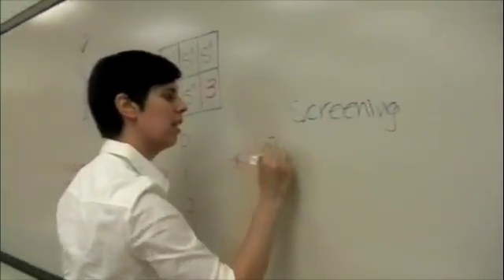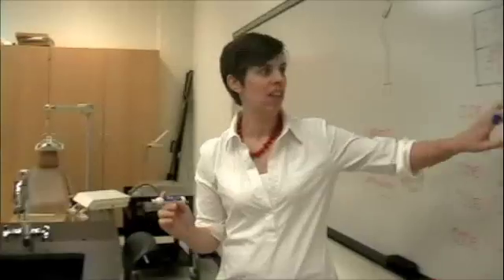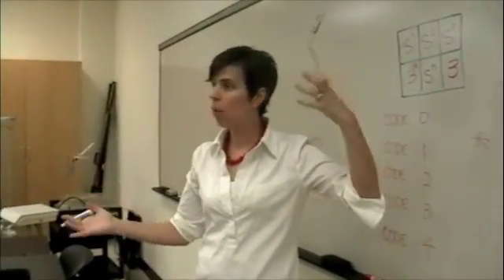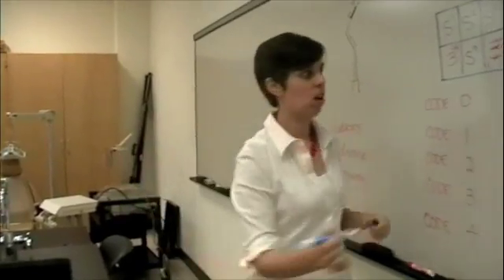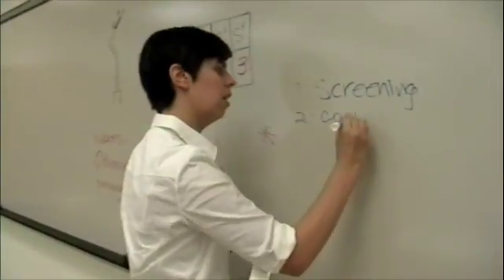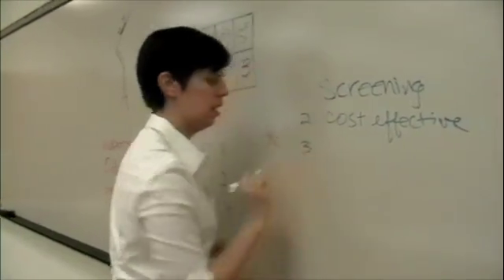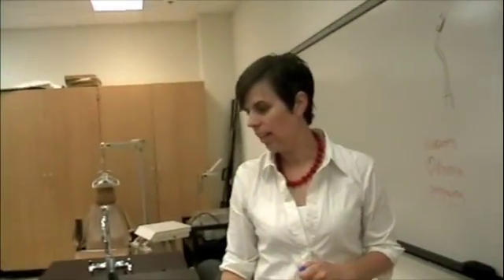Anybody else? Okay, well that's probably the best way. It's a good way to do early detection, so that goes in with the screening. It's very cost effective. You don't have to have a whole lot of equipment or anything like that. All you need is a PSR probe. Also, it's very simple.